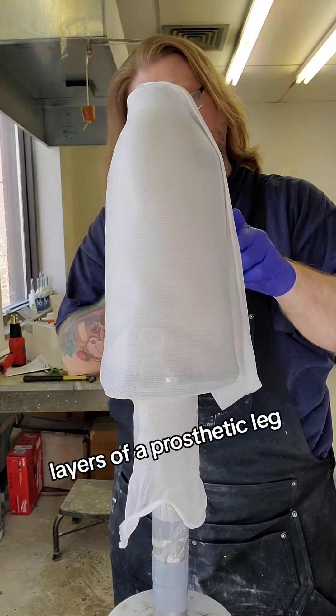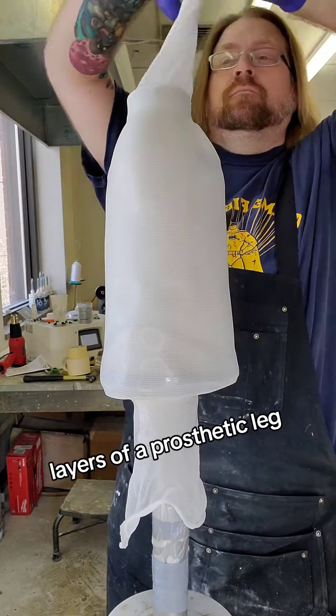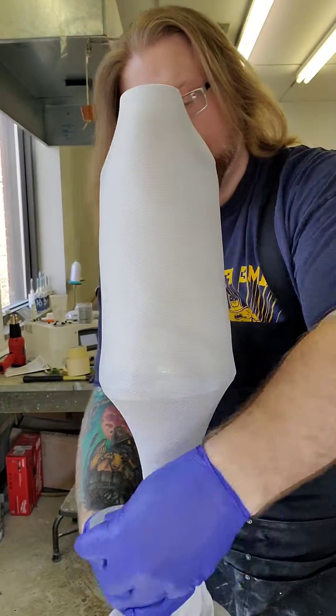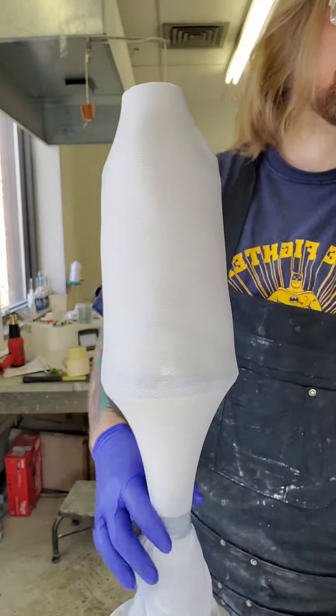Here is a little look at what goes into making a prosthetic. These are the different layers of fabric I use. It starts off with a PVA bag to seal the mold, and then the first layer is a flexi stretch nylon, which is a really nice smooth finish.